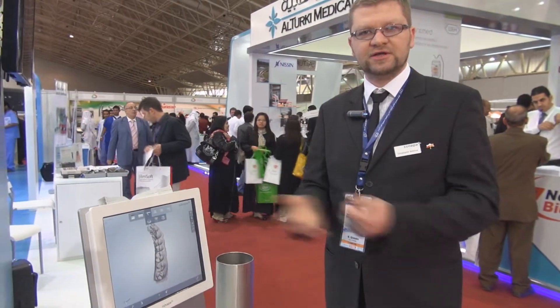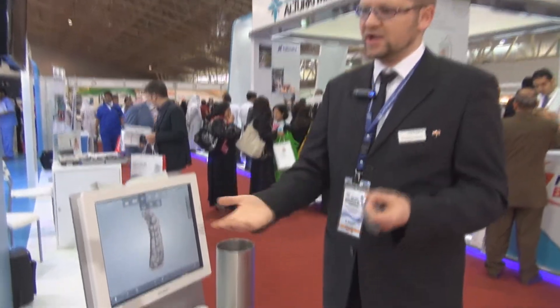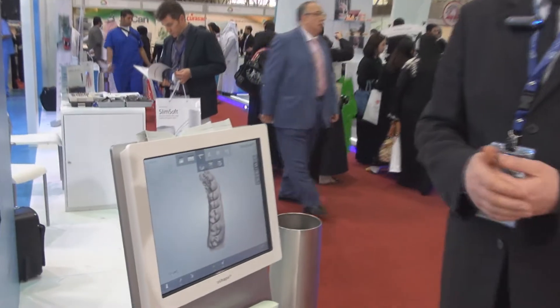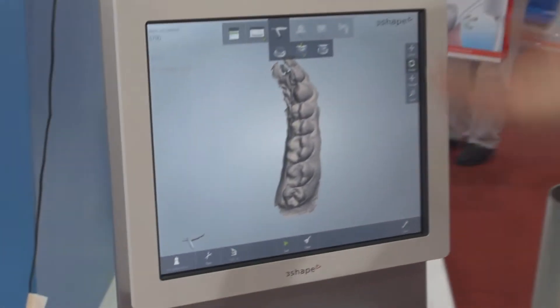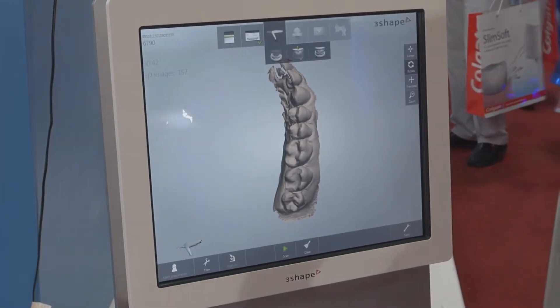These images can be used just like standard impressions for building up prosthodontics, the different restorations, starting from crowns and bridges through dental bars. It's also used for orthodontics and for implant cases as well.